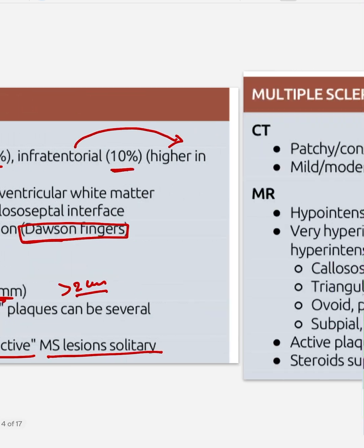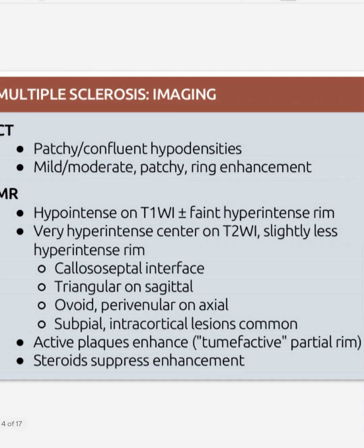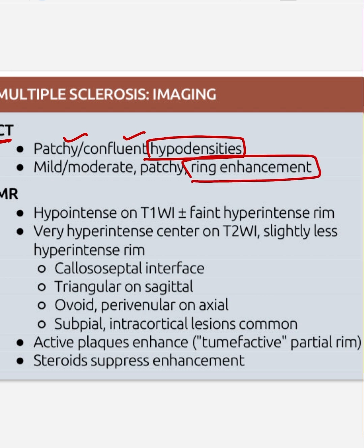In about 30% of tumefactive cases, the lesion will be solitary. On CT scan, there will be focal or confluent hypodensity with mild to moderate edema and ring enhancement. On MRI, lesions are hypointense on T1-weighted images with a faint hyperintense ring around them.